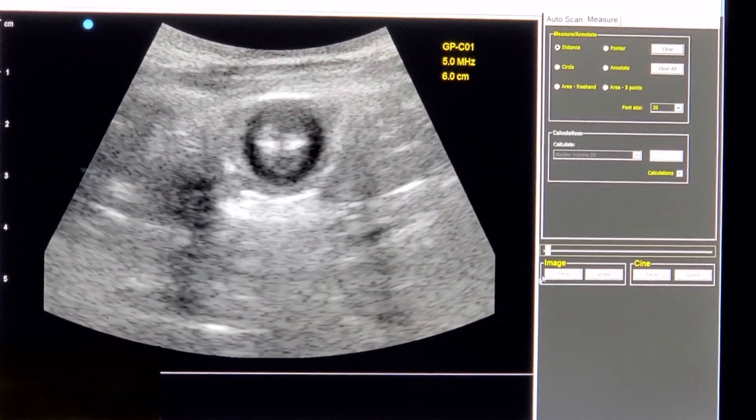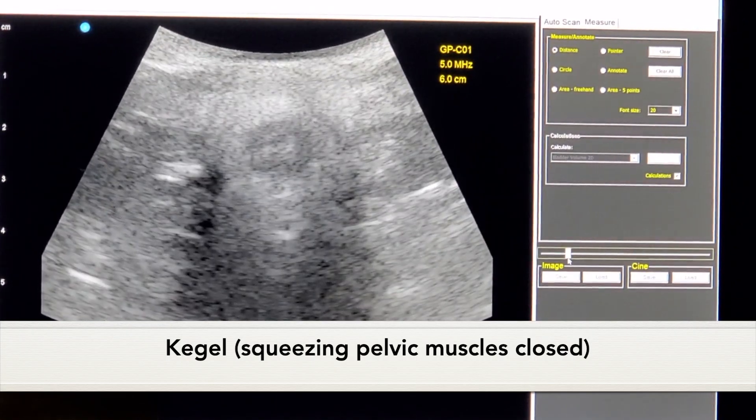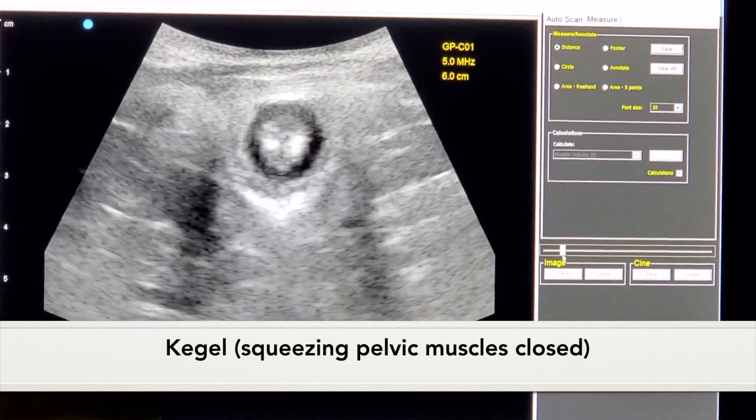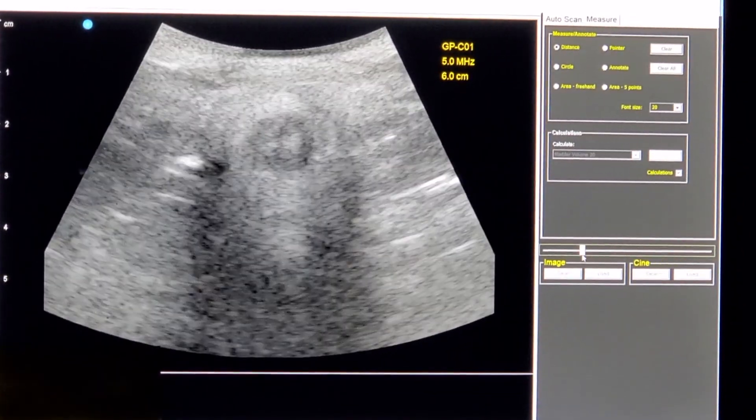The first thing you'll see is the individual squeezing closed — so doing a Kegel, stopping the passage of gas, or holding back a bowel movement. That's what it looks like on the ultrasound, so everything closes up.